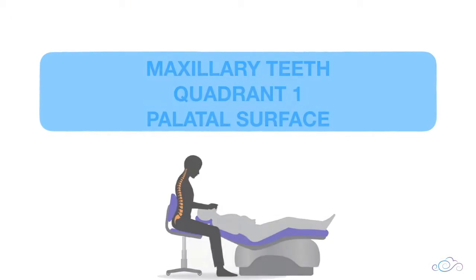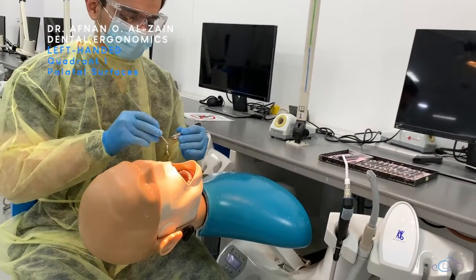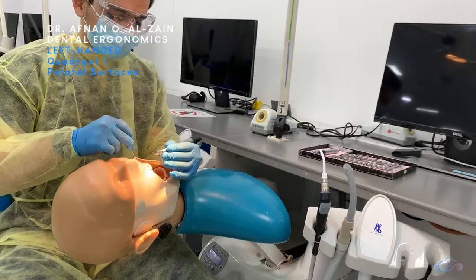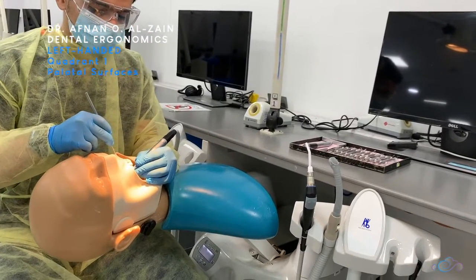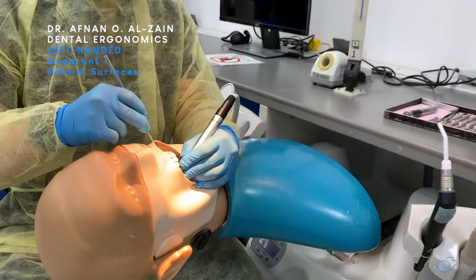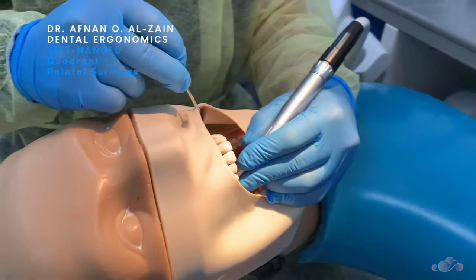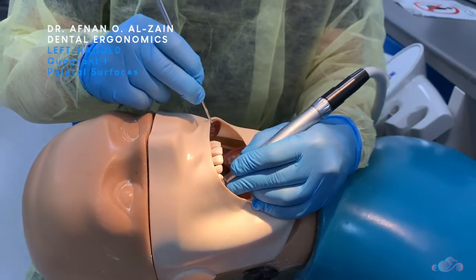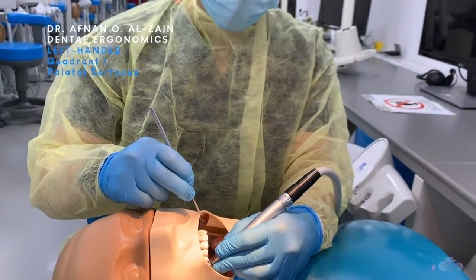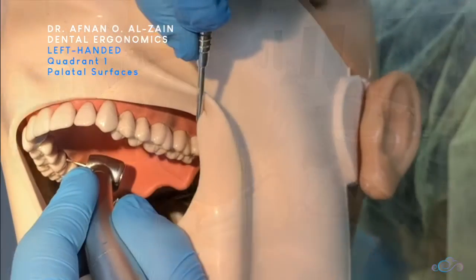Moving on to the palatal surfaces of quadrant one. When working on the palatal surface, you're going to tilt the patient's head a little bit more to the right side, then place finger support and place the handpiece perpendicular to the tooth or to the surface you're going to cut, and look directly at the tooth.